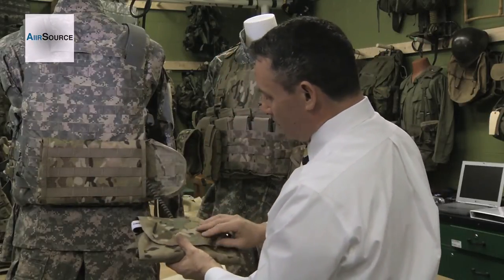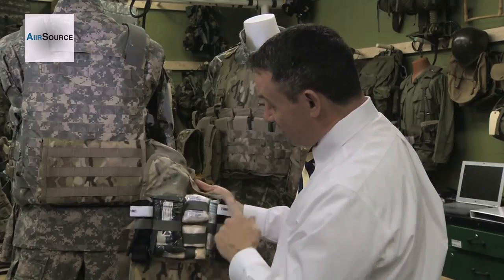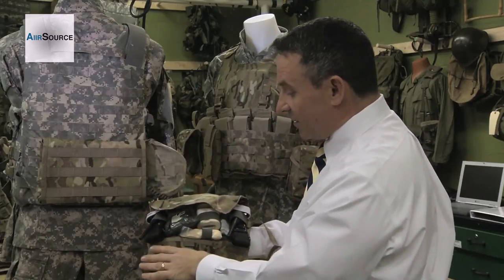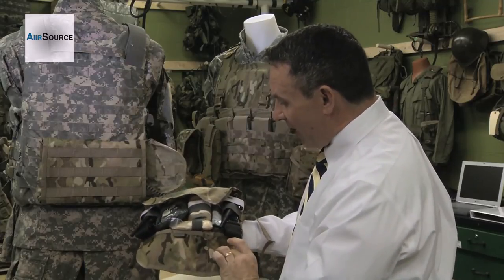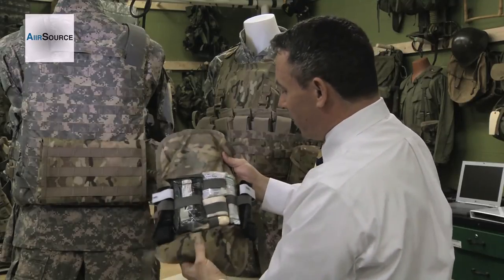The new insert has an enhanced list of components. That enhanced list includes a second CAT tourniquet, a TCCC card, an eye patch mounted here, and a sharpie so the individual soldier can mark on the casualty or the equipment.